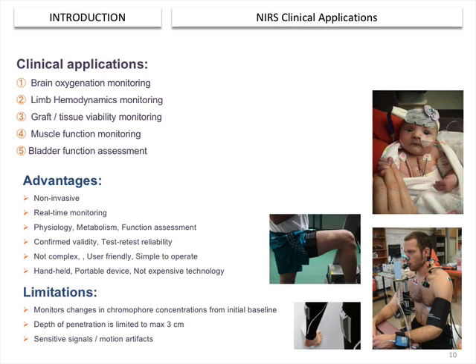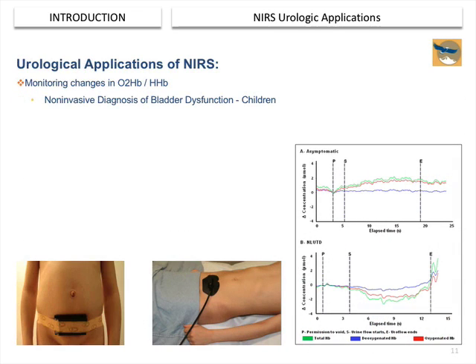Babak, is it also limited by the tissue, so if you're trying to go through bone, is that... No, actually it penetrates bone. 2-3 weeks ago I was at a conference in San Francisco, and people from orthopedics showed how to use near-infrared spectroscopy for monitoring, for example, stress fractures. So easily it can penetrate into the tissue as well. Dental, even tissue, no problem with that. The coefficient of absorption would change, but it can penetrate it.